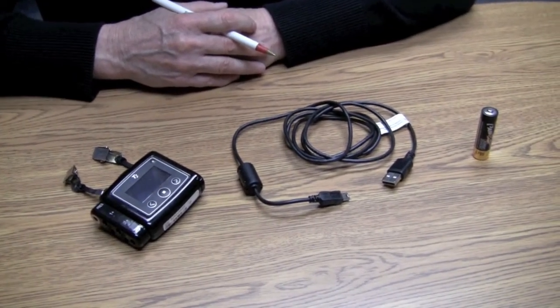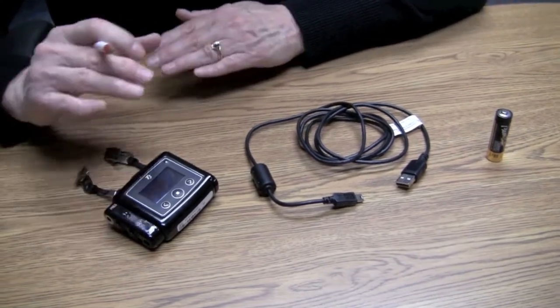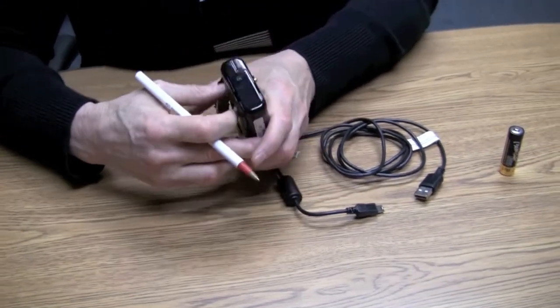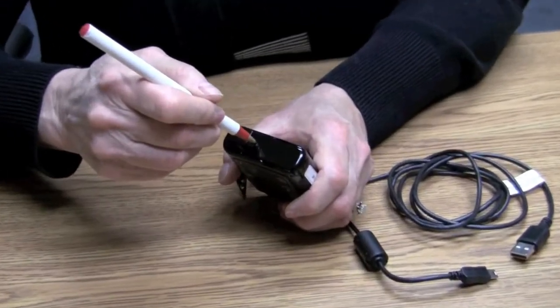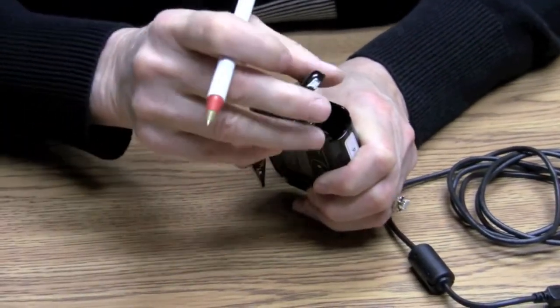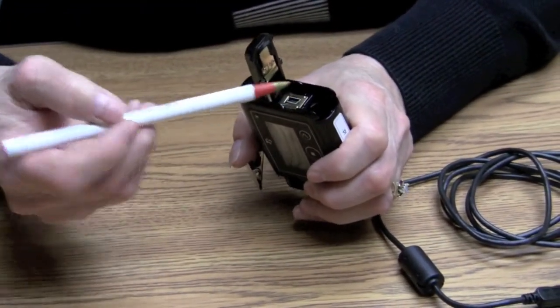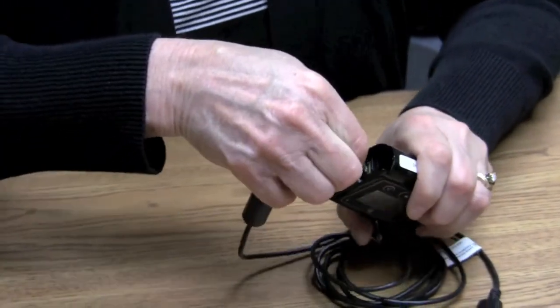In preparation for our patient this afternoon, we want to load the patient's personal information onto the monitor so that it's ready for him to take home. To start, you want to open the battery compartment door by using a pen and pushing into the hole and sliding forward until it pops open. From here you can see that you can either load in the battery or put in the USB cable. For right now we're going to start with the USB cable.